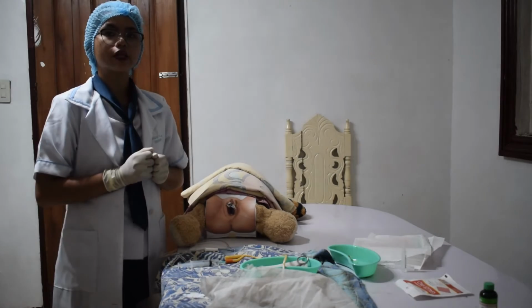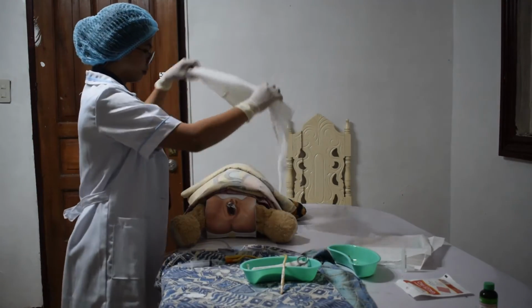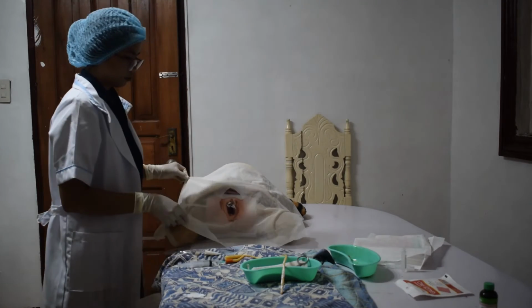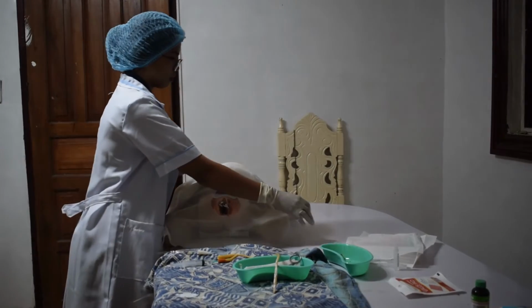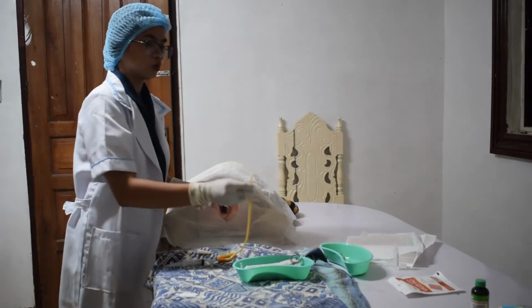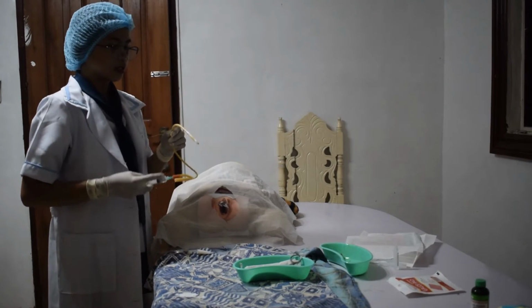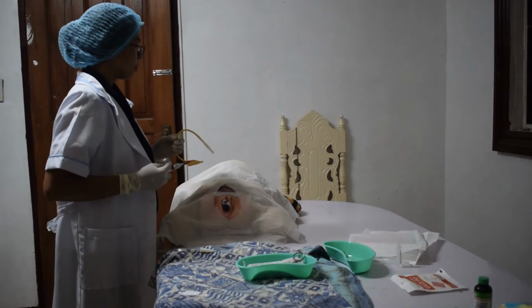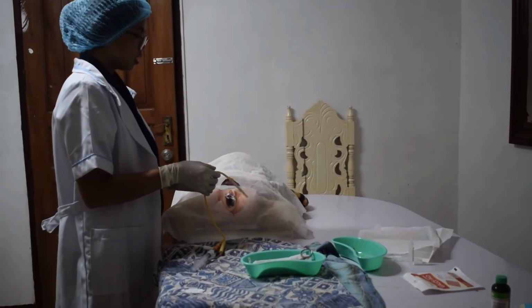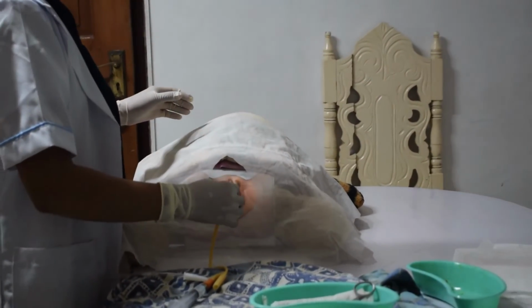Place the sterile eye sheets. Hold the catheter firmly 2 to 3 inches from the tip. Ask the client to take a slow deep breath. Ma'am, could you please take a deep breath? And insert the catheter as the client exhales. Exhale po, ma'am.